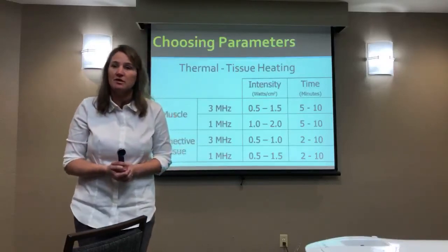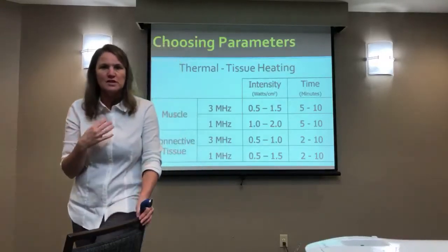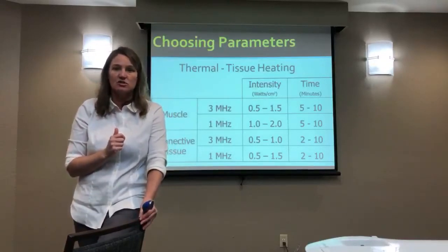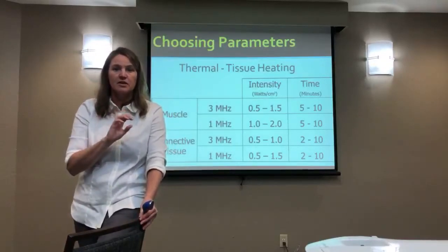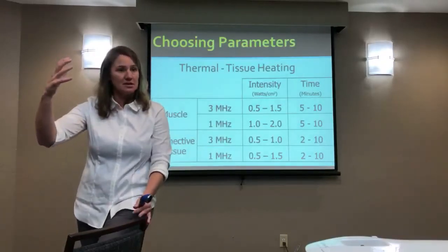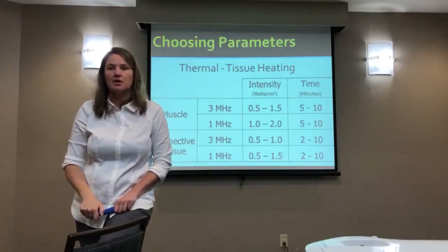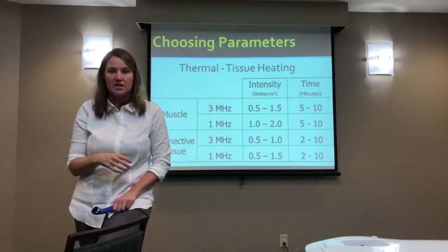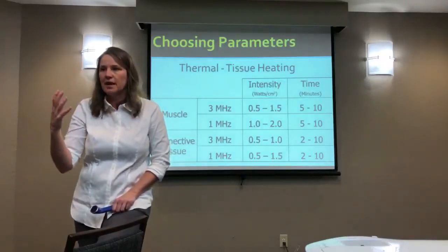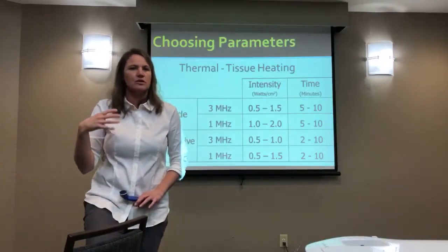Versus if I have someone like in the lab, you guys, you're good communicators, you know what to expect. I'm going to do an ultrasound, and I'm going to say, let me know when it starts to get uncomfortable, and we're going to back it up. So if my purpose is to get it robustly heated, and I feel confident that I'm not going to overheat it, they're going to let me know, they have good sensation, then you have the ability to be a little bit more aggressive, for lack of a better word. Athletes come to mind, or something like that.